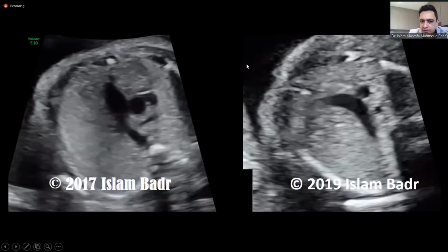The vessel coming anteriorly from the anterior of the heart is not coming straight like the pulmonary artery. No, it's not coming straight. It's assuming the normal curve of the aorta. So what's coming anteriorly from the heart is the aorta, not the pulmonary artery, as should happen in normal cases. So if you compare the normal pattern from the abnormal pattern, I think the process of pattern recognition will be extremely easy, and you can diagnose transposition of great artery with confidence.